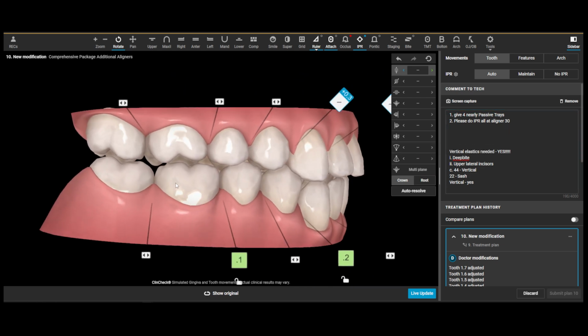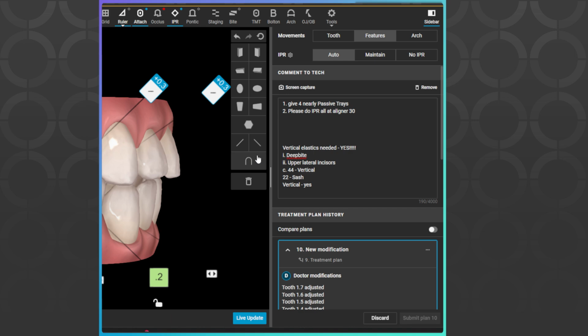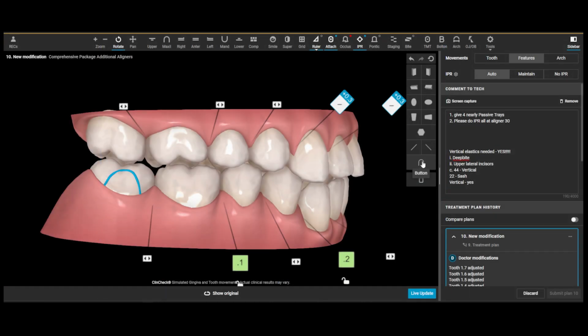Okay, let's say I need vertical elastics now on these teeth. I can just click on the features button, drag over my elastics, right, this little guy right here, the button. Drag it onto all of my lower teeth.